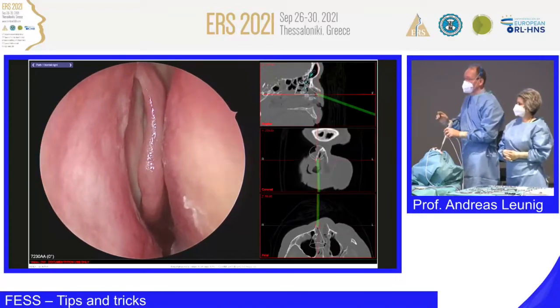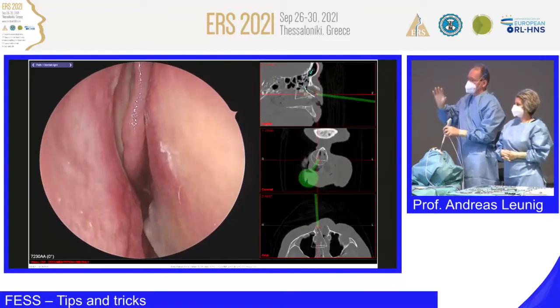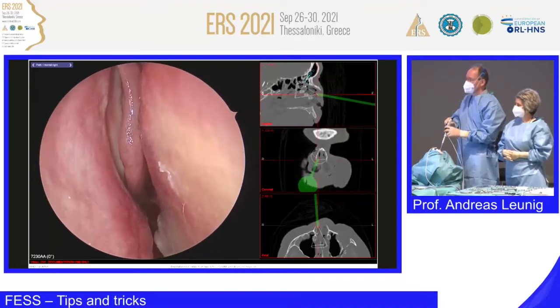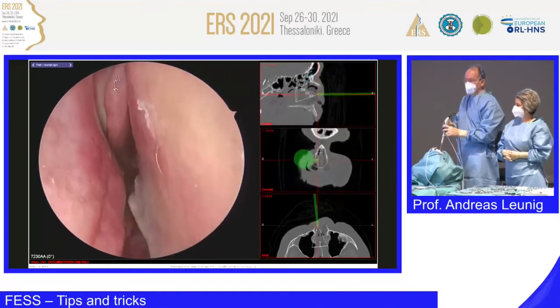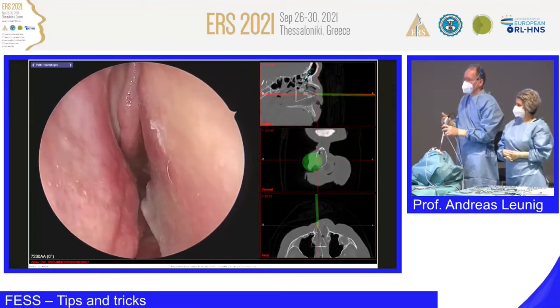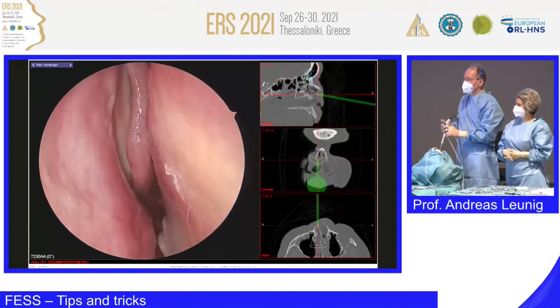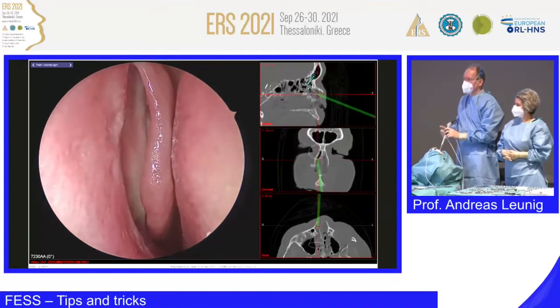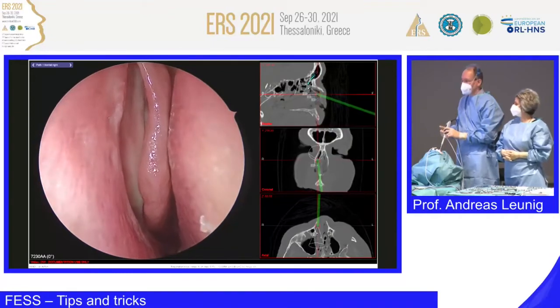And now we are facing already very nicely into the septum, which is a little bit deviated. We have here a little septum spur or crest. We have the inferior turbinate. We have a nice view onto the middle turbinate. And in between, the uncinate process.